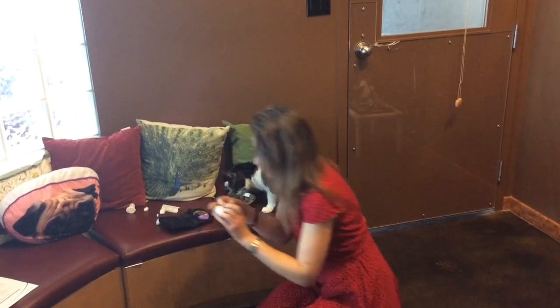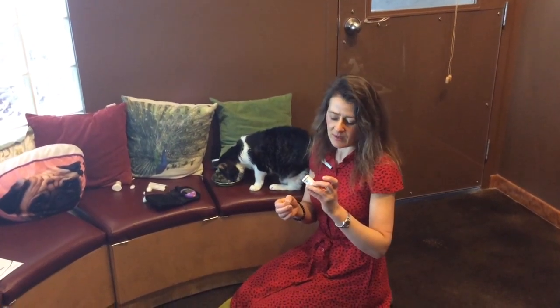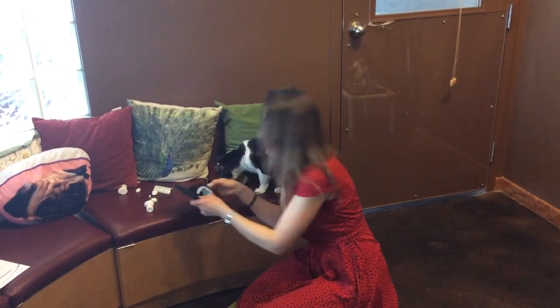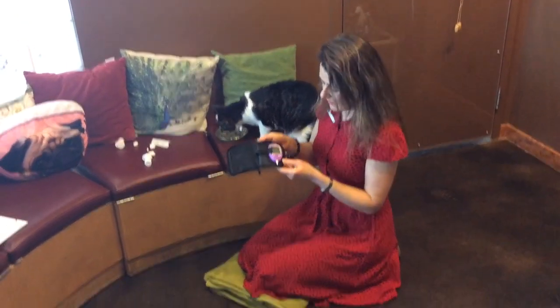The strip kit comes with a number — in this case the cat number is 38 and the dog number is 36 — and it always says so at the back of the container. I basically place the strip inside the reader and there's only one way it will go, and you wait until the number comes up.